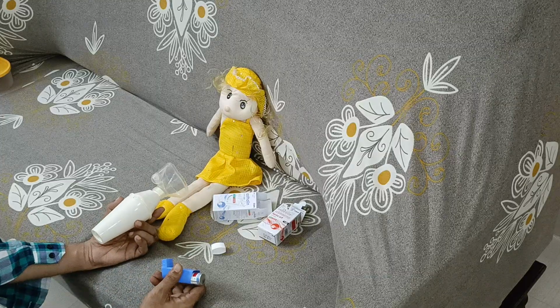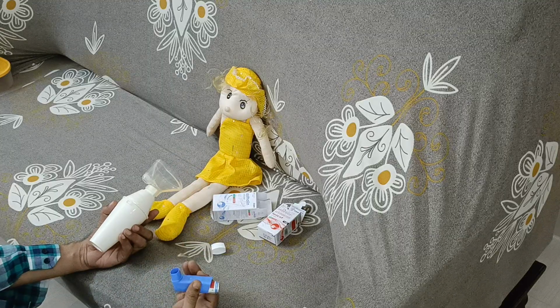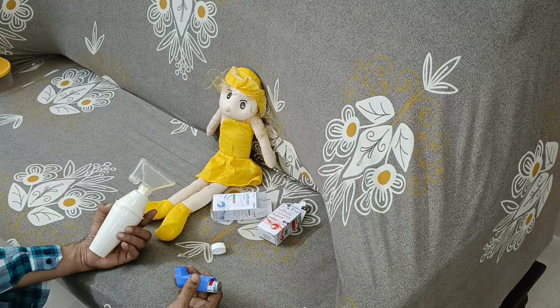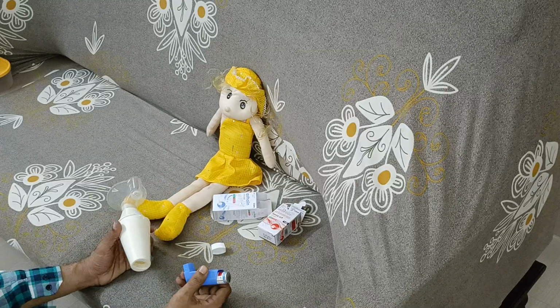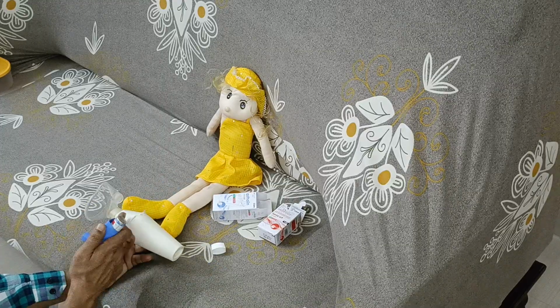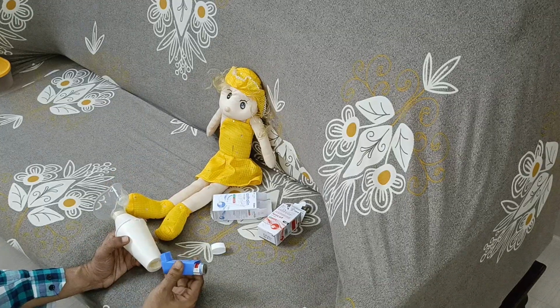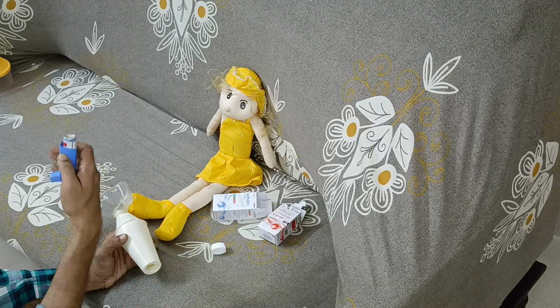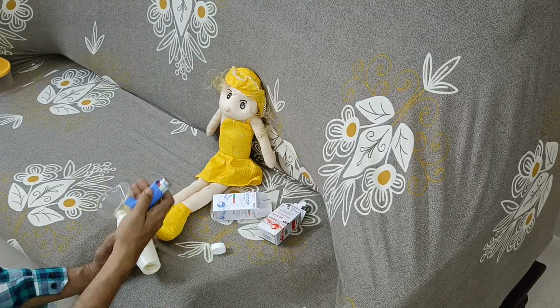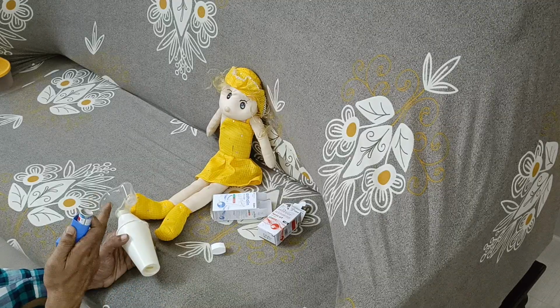Okay, now I'm going to leave it over here. For example, the patient's name is John. John, I have the inhaled medicine for you. Can I proceed? Is that okay with you? This is the mouthpiece, this is the spacer, and this is the canister. When I attach the canister over here, I'm going to press down. You have to take a slow breath of 2 to 3 seconds. I will count, hold it for 10 seconds, and then you breathe out slowly. Is that okay with you?